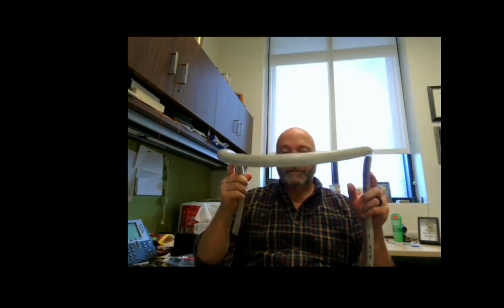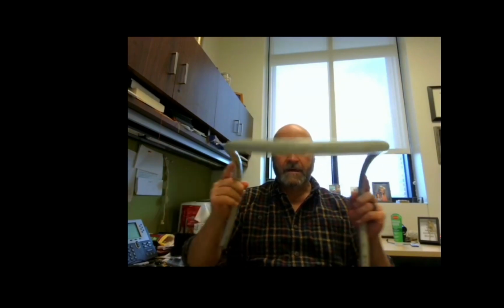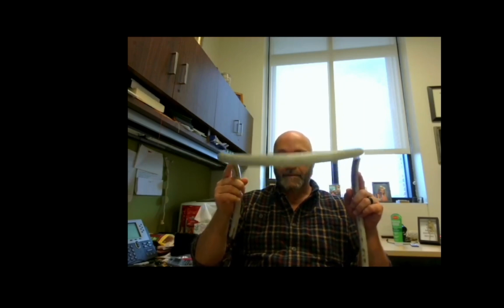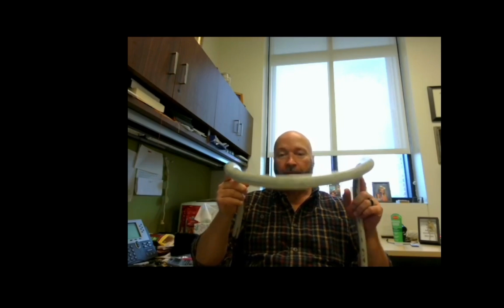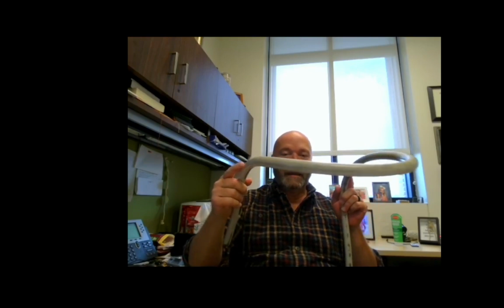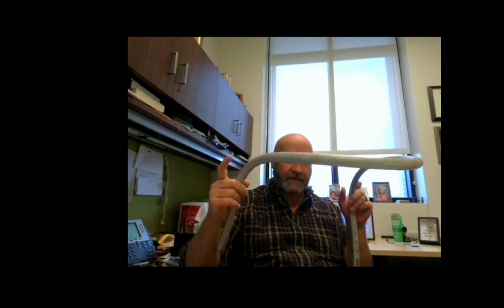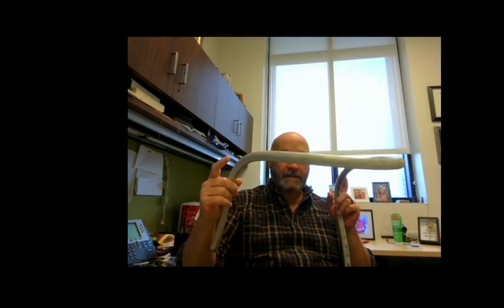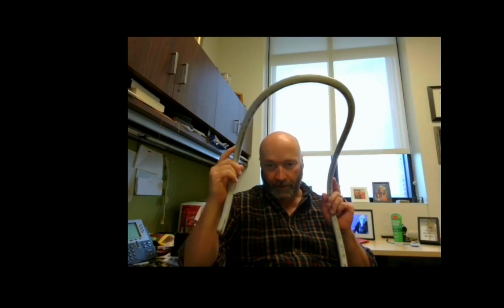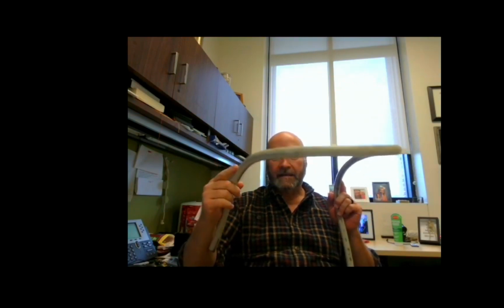But if you recall from AP obliques, what we saw was the flexure on the elevated side. So if you were looking down from the ceiling at me, laying flat on my back, or at this patient laying flat on its back, and I were to rotate what would be the patient's left-hand side towards me, and the right-hand side will be elevated, then in AP obliques, if you recall, we see the elevated side. So in this case, what we would see is a hepatic flexure.